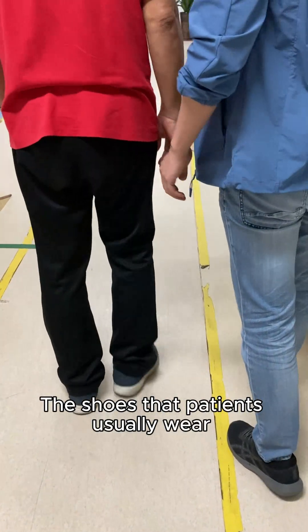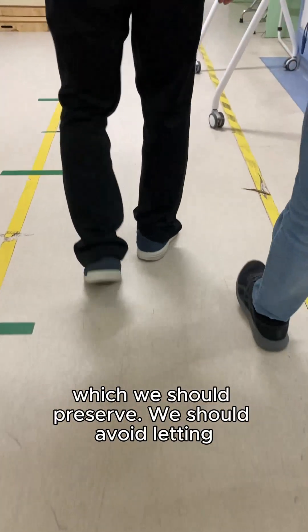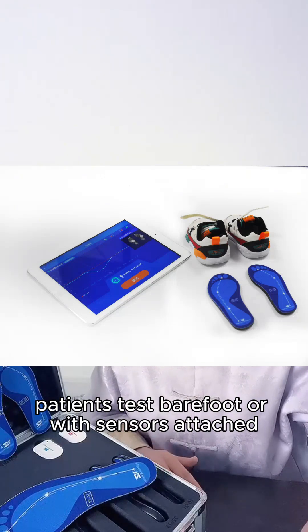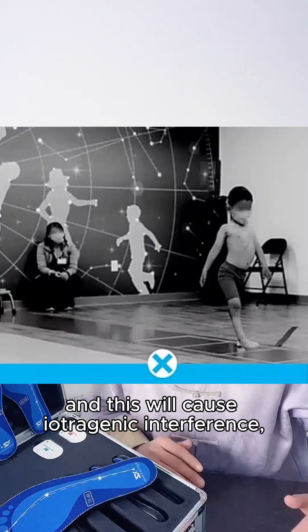The shoes that patients usually wear have their own gait characteristics, which we should preserve. We should avoid letting patients test barefoot or with sensors externally attached, as this will cause iatrogenic interference.